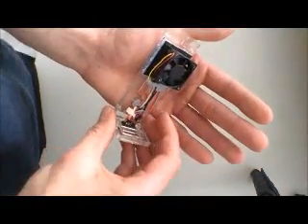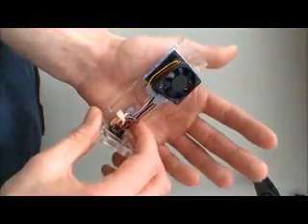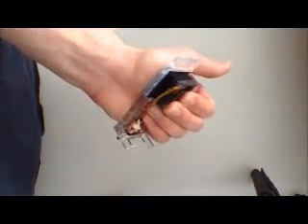But hopefully, with the next project, we're looking to add a foam grip, so rather than it being a piece of plastic in your hand, which can be quite uncomfortable, there'll be a bit of foam. It'll curve to your hand, making it more ergonomically friendly.